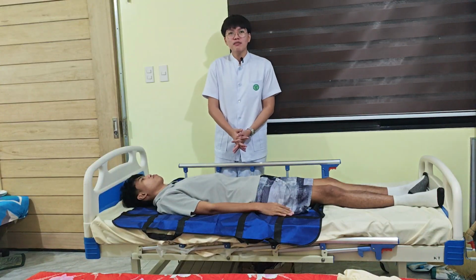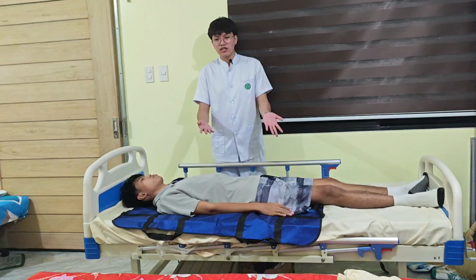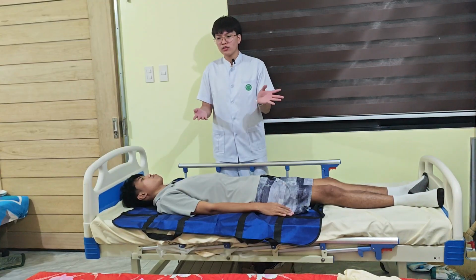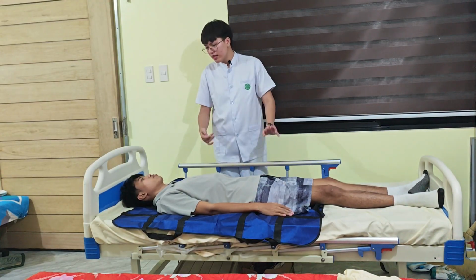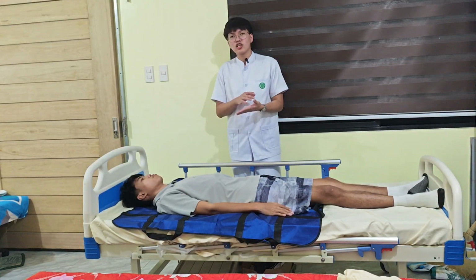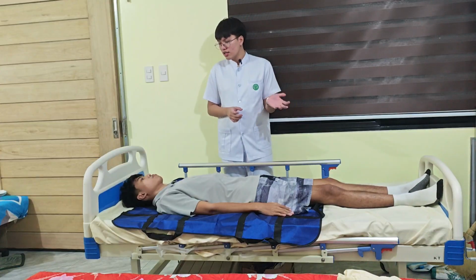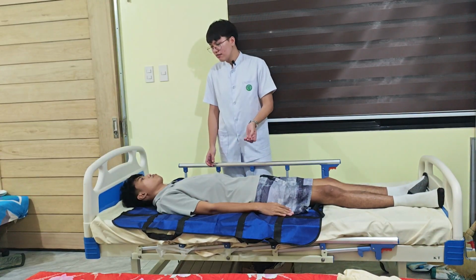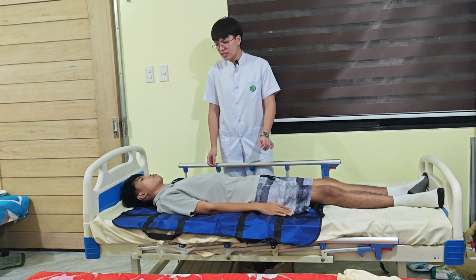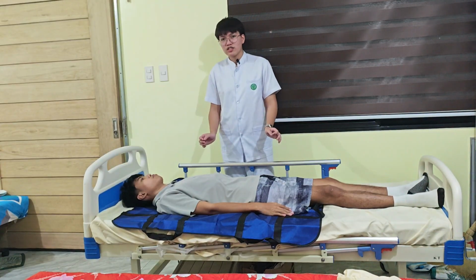Good day. So for today, I'll be demonstrating transferring from bed to stretcher. Since we don't have a stretcher, we're going to improvise using another bed. The first procedure is to check the patient's chart, MAR, or nursing plan of care, as well as the patient's limitations and whether there are any tubes or IVs attached to the patient, to safely transfer the patient to the stretcher.